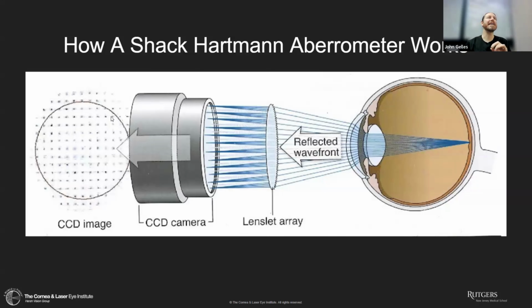And what we're looking at is the clarity of each point here. Each one of those points corresponds to a different point of light that's coming through a different portion across that pupil, right? So we're looking at the clarity of vision of that individual at any point across their pupil.